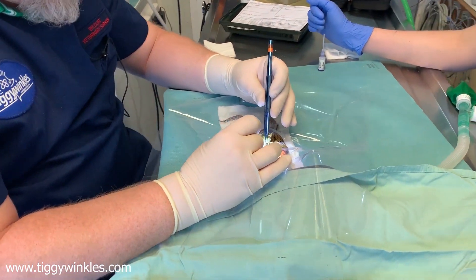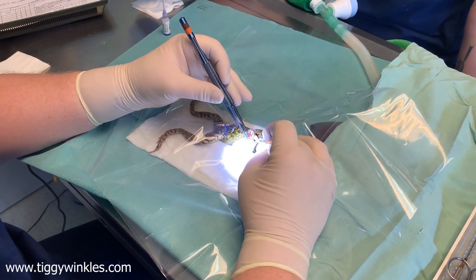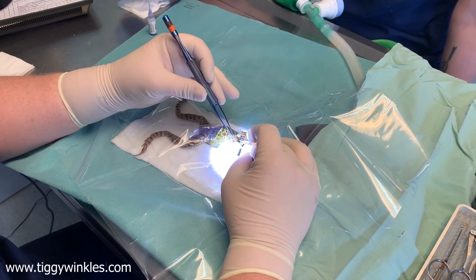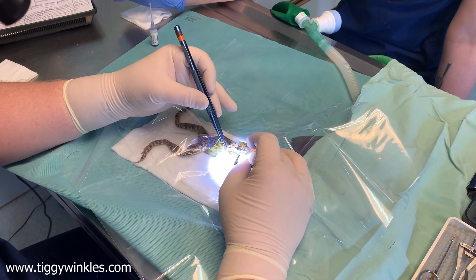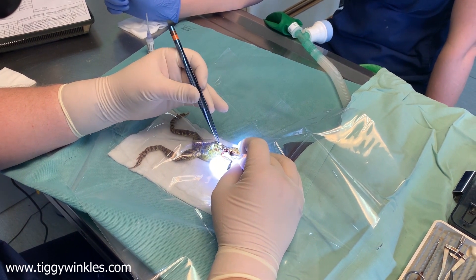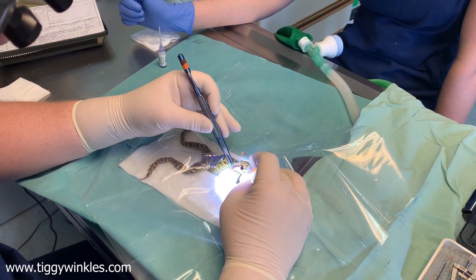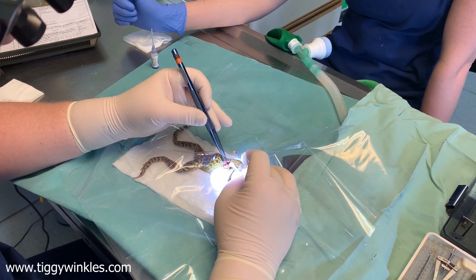The problem we have here is he's damaged his leg — the bone is sticking through at the bottom. It's all quite damaged underneath; we haven't got much spare tissue here, but we've got some spare skin over the top. What we're going to do is remove all of this. The end of his bone is now free, still attached with a bit of muscle. That's the end of his humerus, which is clearly shattered. We'll take that off and tidy this up — reduce the bone back a little bit and close it so he has a more functional amputation rather than the traumatic amputation he's suffered.